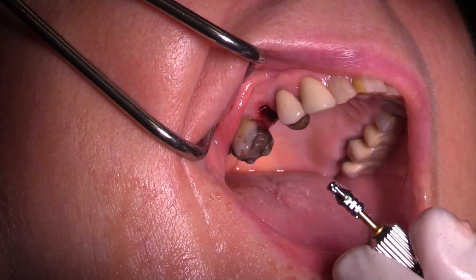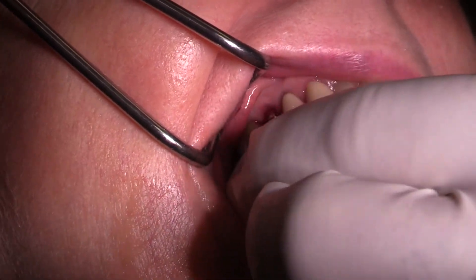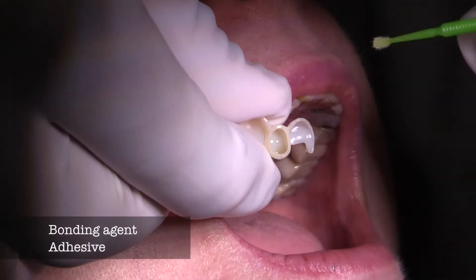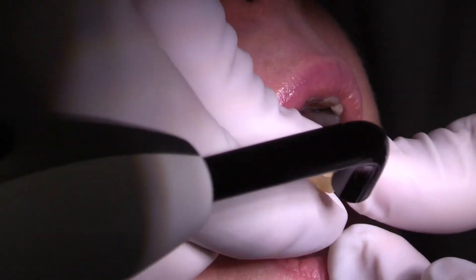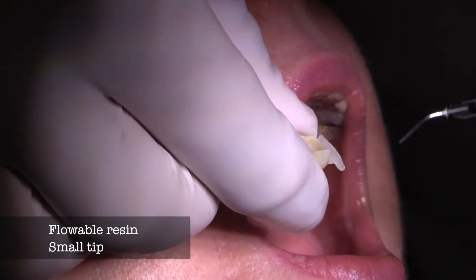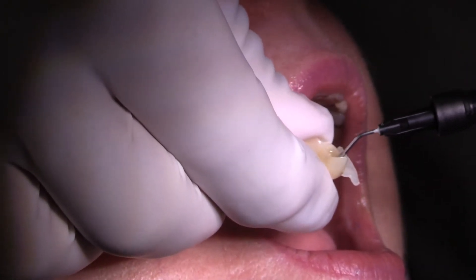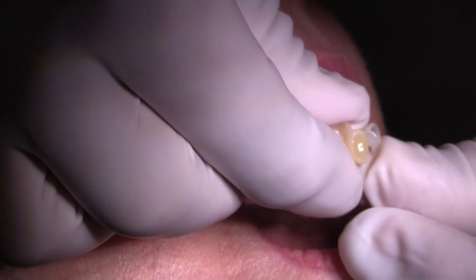We'll take the temporary cylinder and place it into the implant without a screw, then take an x-ray to verify it is seating properly prior to seating the temshell on and gluing these together. You can see it is seated, and the CC bone mill has been used to do that. Now we'll apply some bonding adhesive, which will enable the flowable composite to bond to the temshell. We'll use flowable resin with a small tip — we can fill the temshell confidently because there are three millimeters of clearance down to the implant, so it won't lock around it.